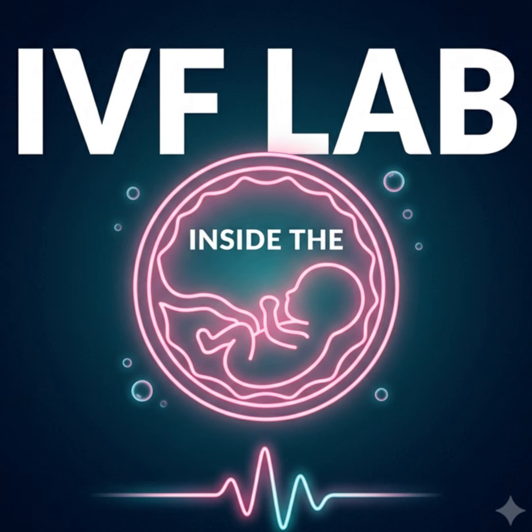The AI revolution. It feels like every single industry in the world is talking about AI right now, often as a buzzword. But in the embryology lab, it actually makes perfect logical sense. You have a captive audience, a standardized environment, and a massive, continuously growing data set of high-resolution images just waiting to be mathematically analyzed. Time-lapse incubators created the ideal training ground for machine learning.